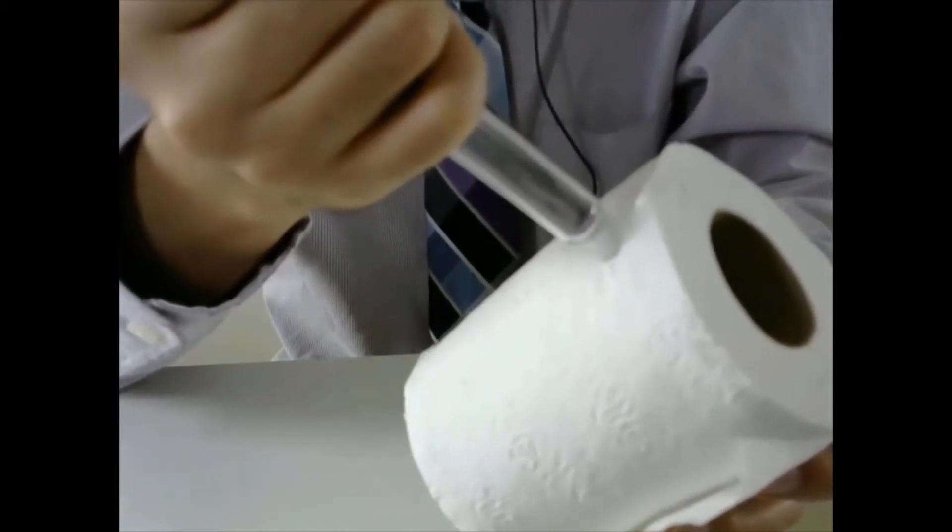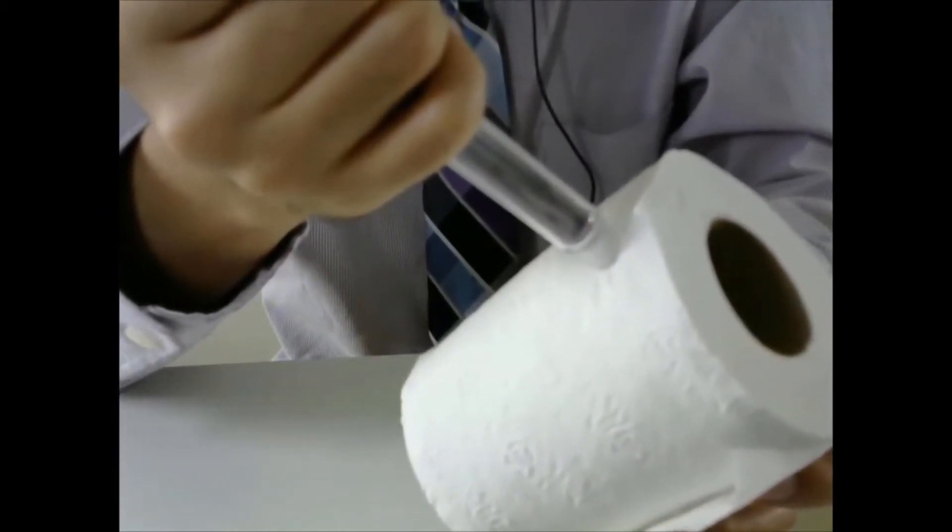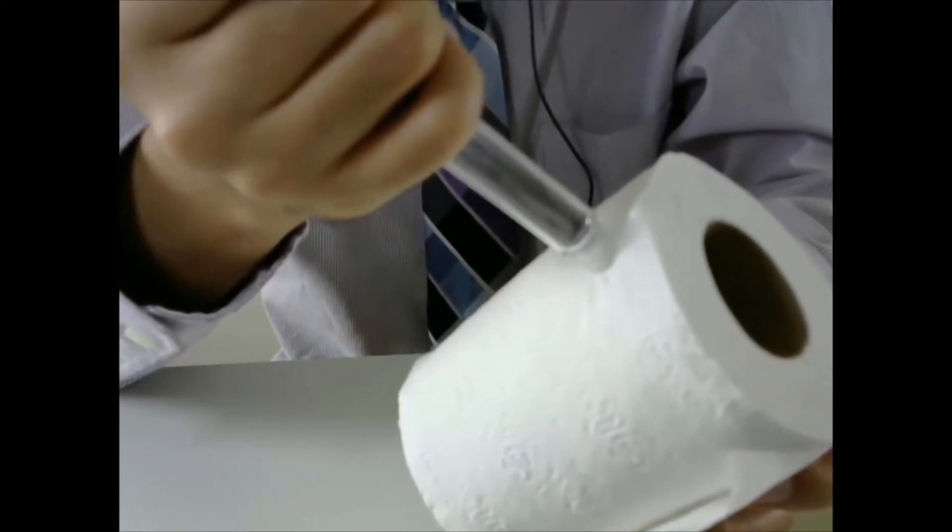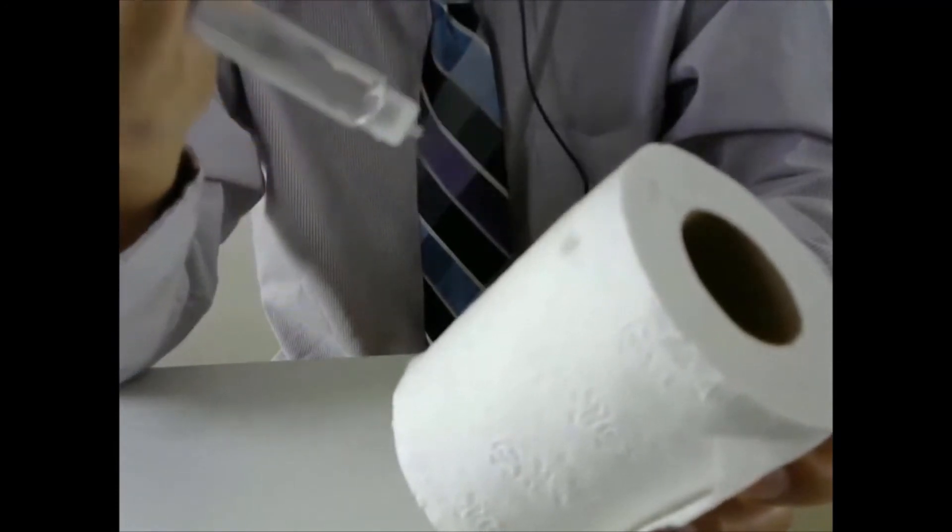The pen should stay there for 5 seconds to make sure all the insulin comes in. Then you can remove the pen.